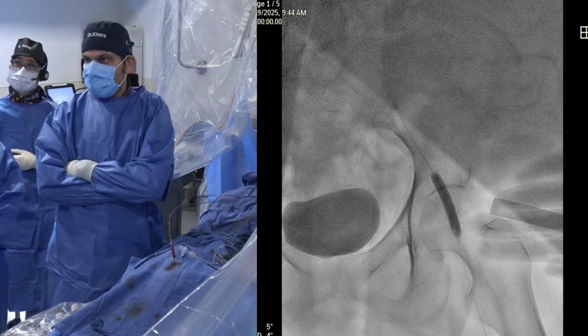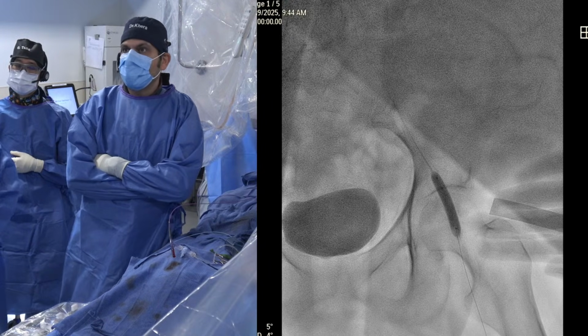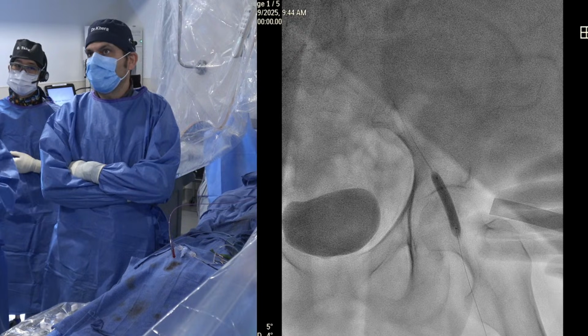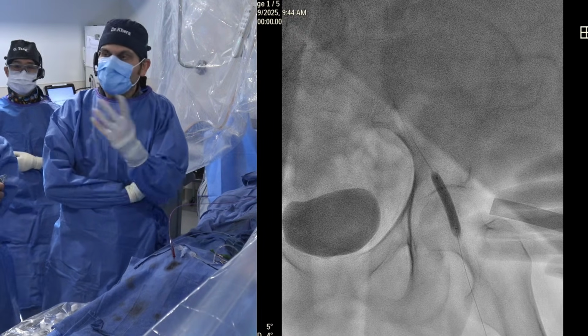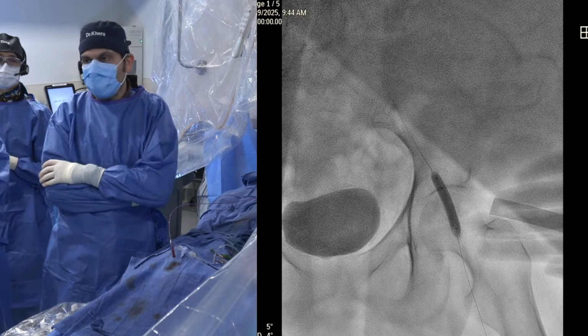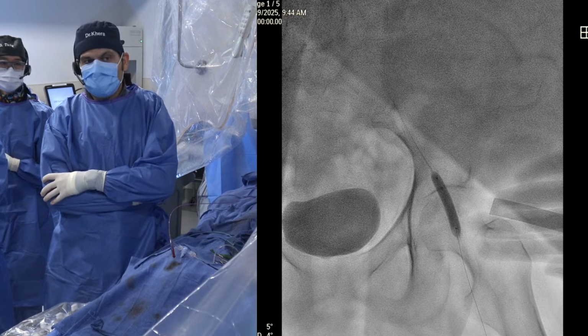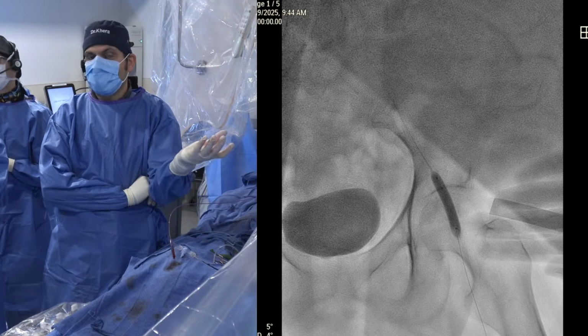Is there any situation where you will not use the wiring? Anytime there's an EVAR case where you have 2 limbs, or the patient has a very acute angulation, then you don't waste time doing up and over wiring. Although you can in those cases, we try not to because the equipment becomes really expensive. And otherwise, for the most part, if they have had a renal transplant on one side, then we don't take access, it's a single access case.